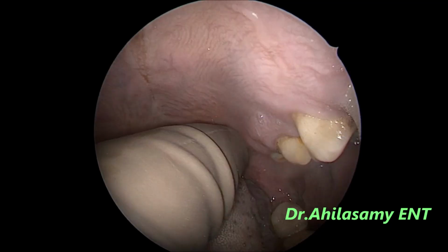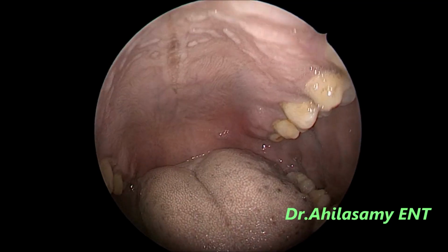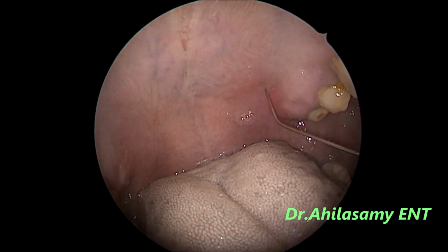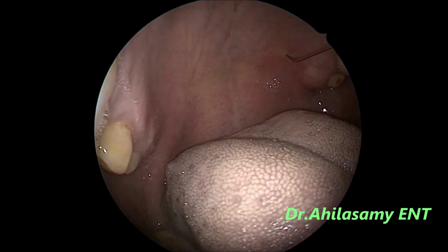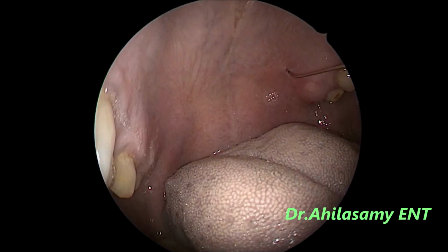Now I am going for the greater palatine block, or the transoral sphenopalatine block, for the left side. Palpating the foramen, I am using the 23 gauge needle bent for around 2 centimeters, making sure it's going into the foramen.